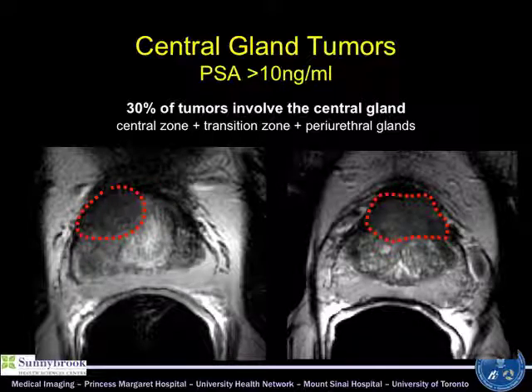And what this looks like, and I like this description, is if this was a charcoal drawing, someone took a wet thumb and smeared across that area. The texture is very different. Both the directed biopsies in this patient came up with higher grade, high volume disease. And I don't think this would have been picked up easily with routine transrectal biopsy.